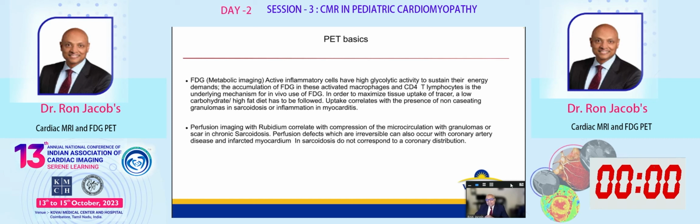About 15 to 20% comes from glucose. The breakdown of fatty acids in the mitochondria is through beta oxidation, and it's exquisitely sensitive to oxygen deprivation. So when you have reduced oxygen supply, the myocytes compensate for the loss in oxidative potential by shifting towards glucose as an energy substrate. When you use FDG for PET, it enters myocardial cells by the same transport mechanism as glucose. And once it's in the cell, it's phosphorylated to FDG 6-phosphate.